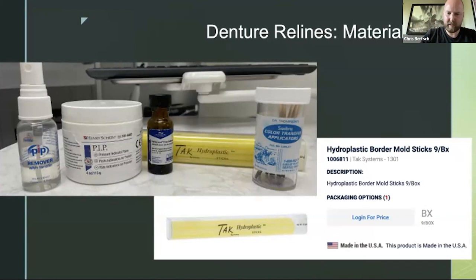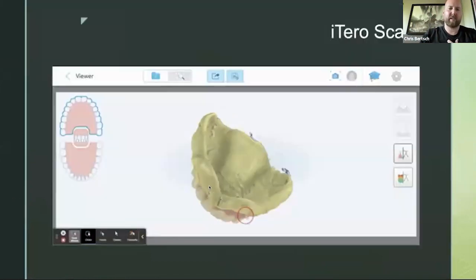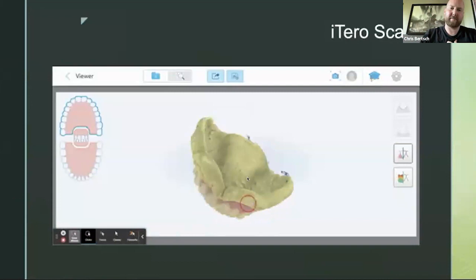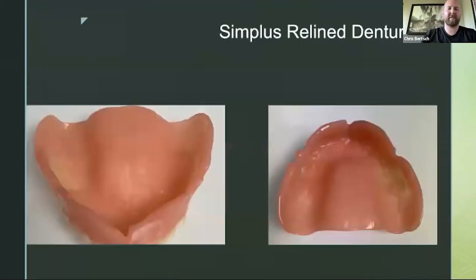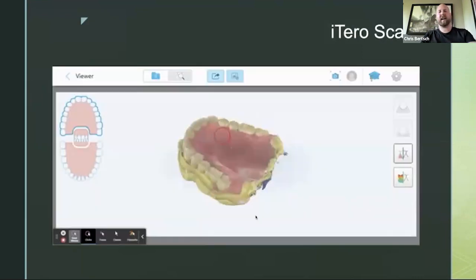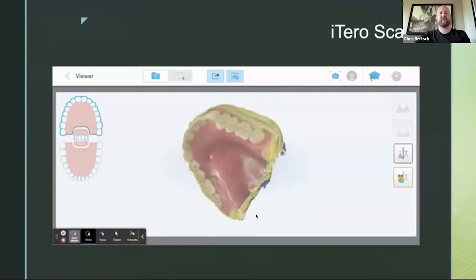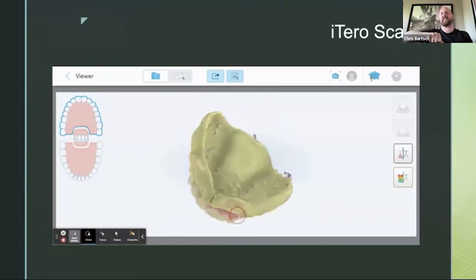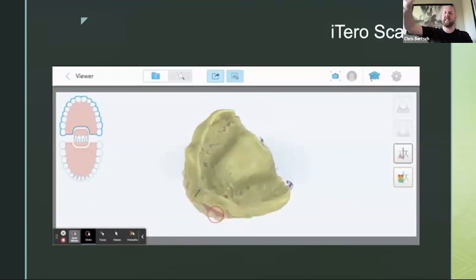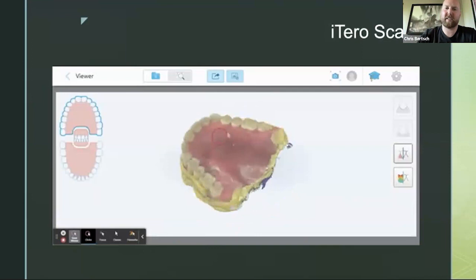So like here, where it has the material on the back, just the rough edges at the very posterior of the denture. So I'll start there scanning, scan from the 7 all along 7, and then moving my way forward in a motion like this. And that's how I capture it, because otherwise it is a challenging area for sure.